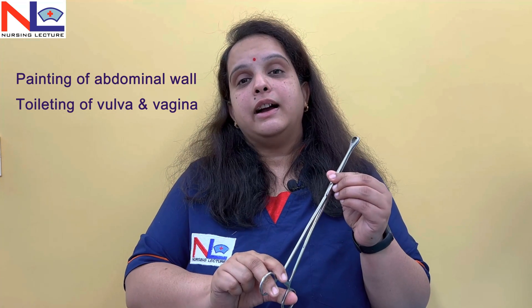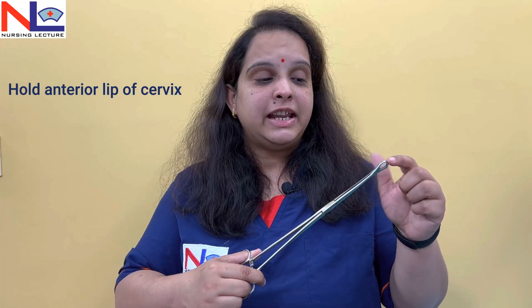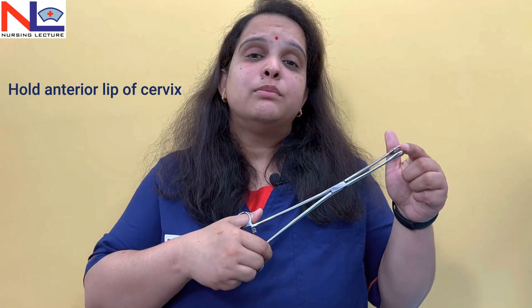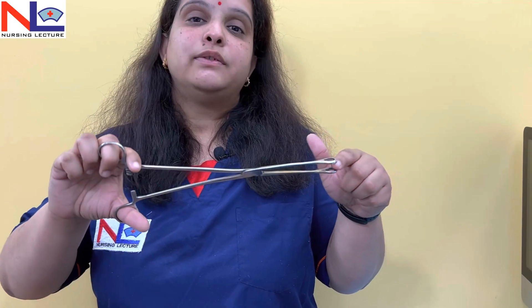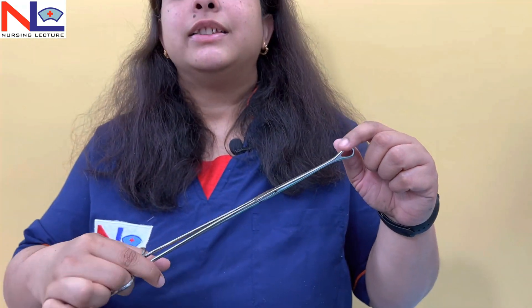Painting and toileting are the most common purposes behind using this forcep. Another use is to hold the anterior lip of the cervix, because some traumatic instruments have many teeth. Since the pregnant uterus is softer, we use this sponge holding forcep to hold the anterior lip of the cervix as it causes less damage. In cervical cerclage procedures, where we need to hold the cervix to perform the cerclage and make the cervix competent, we use this instrument. Even in the management of the third stage of labour, to hold the fetal membranes while the placenta is delivering, we use this forcep because it will not tear the membranes.